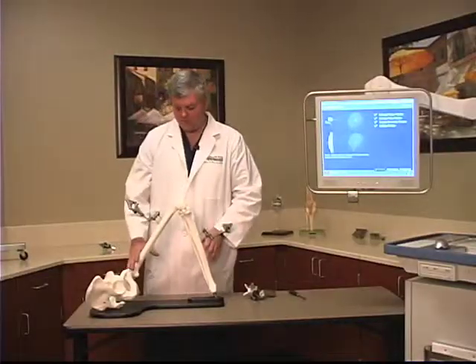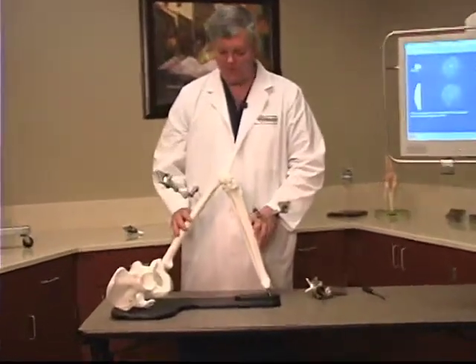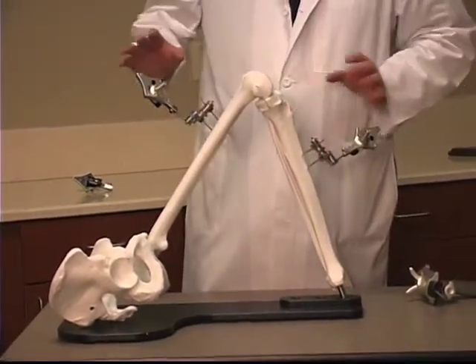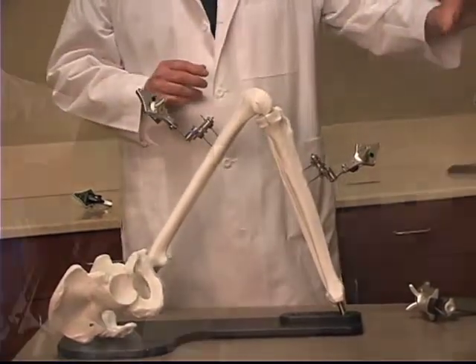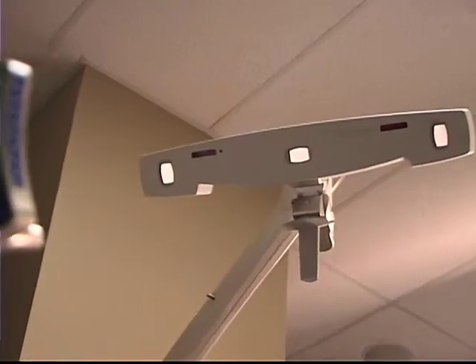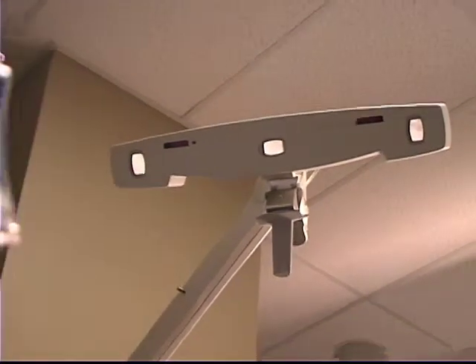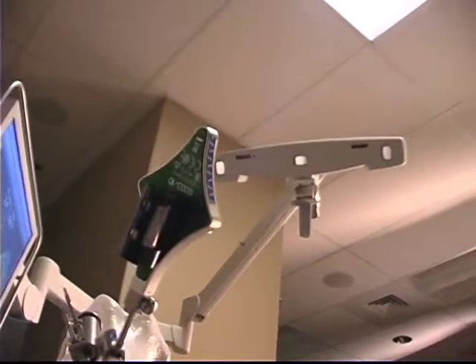This is the sawbones model, the pelvis, the thigh bone or the femur, the leg or the tibia, and attached to these two bones are markers. These markers communicate with the computer. It's essentially a global positioning network brought into our OR. Essentially a GPS system brought at a microscopic or a minimal level, but extremely accurate.